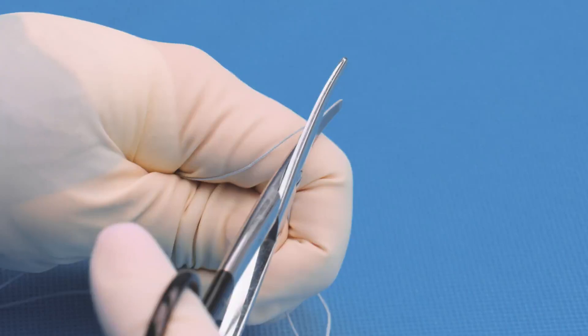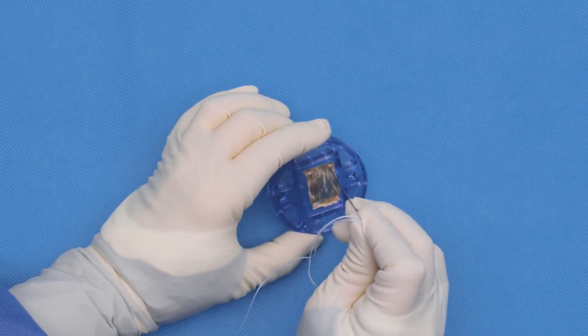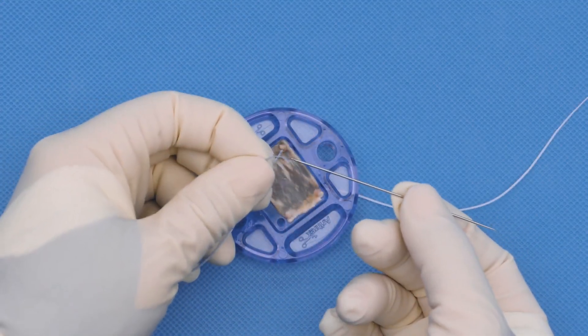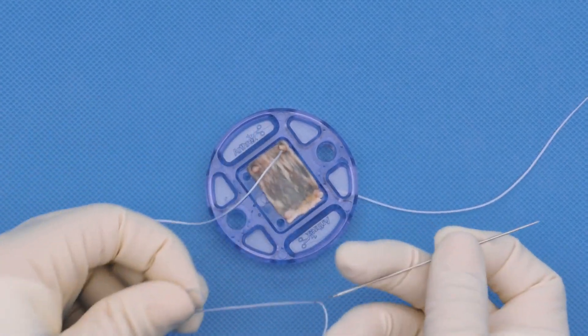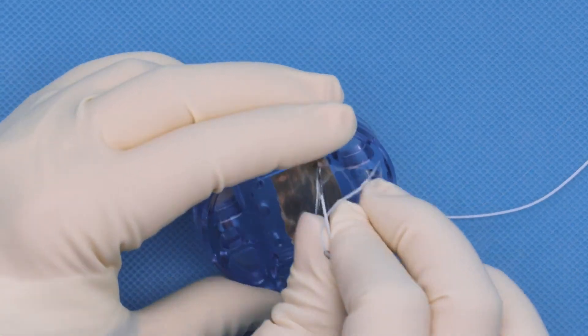Cut the thick part of the fiber loop off, and use the keith needle to pass one end of the suture through the corner of the graft. Remove the needle and thread it onto the opposite end of the suture. Pass the other end of the suture through the graft, creating a mattress stitch.